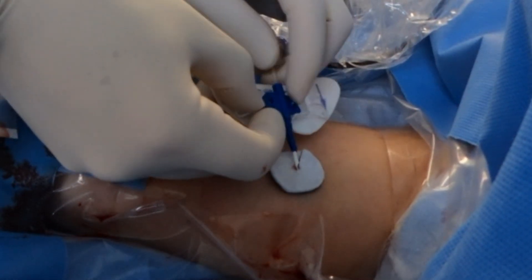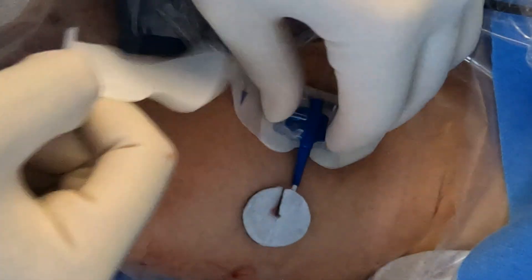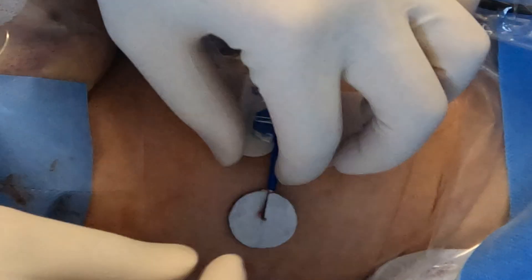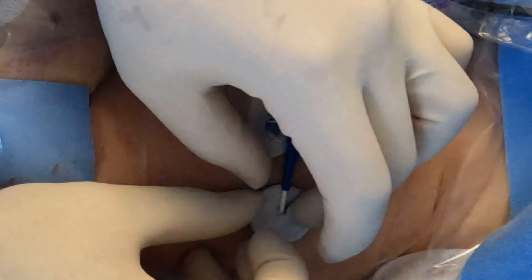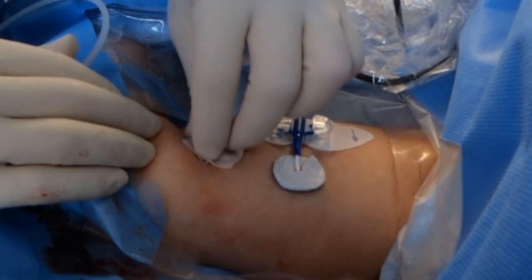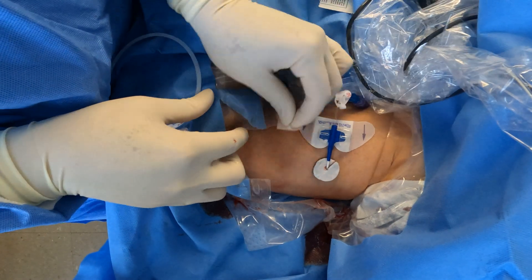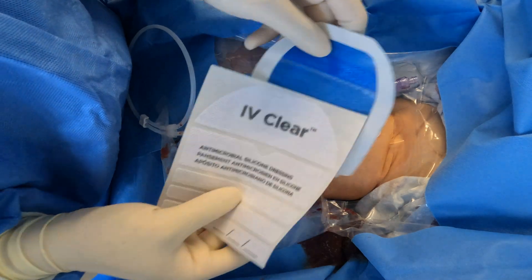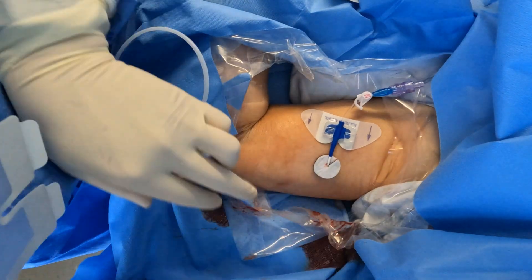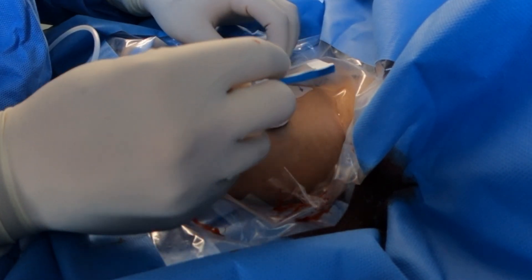Now we're going to apply the StatLock — this is your securement device. We're only keeping this line for the surgery, so I'm not worried about longevity of this particular catheter. I'm going to apply the skin prep around the skin. Today we'll also be using IV Clear — this is the silicone-based adhesive. It's softer on the skin and less abrasive during removal, highly recommended for patients with high sensitivity to adhesive.